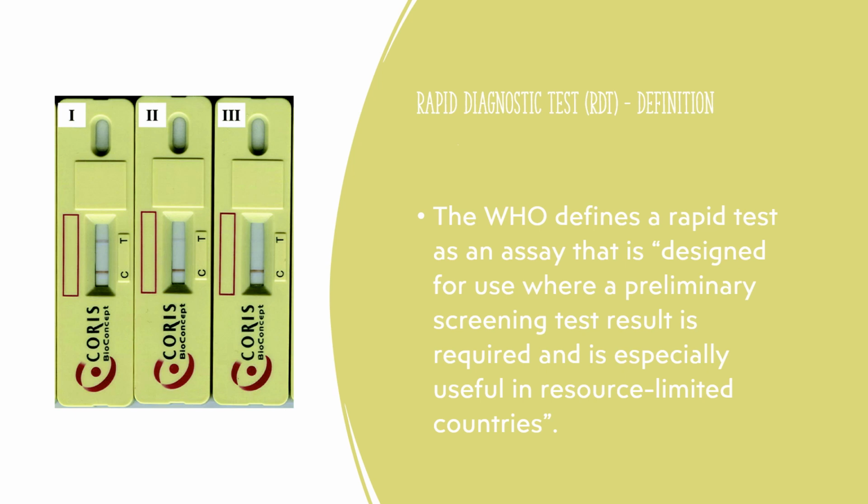Rapid diagnostic test definition. The World Health Organization defines a rapid test as an assay that is designed for use where a preliminary screening test result is required and is especially useful in resource-limited countries.